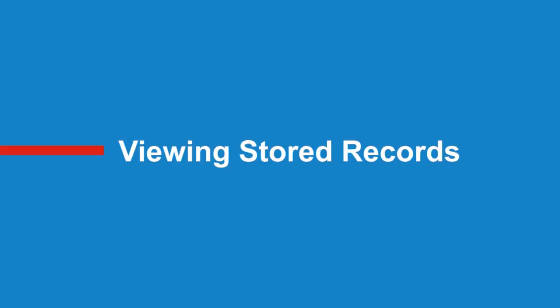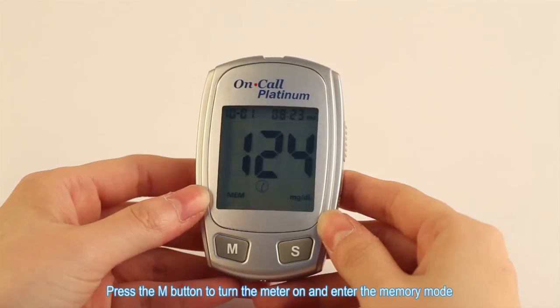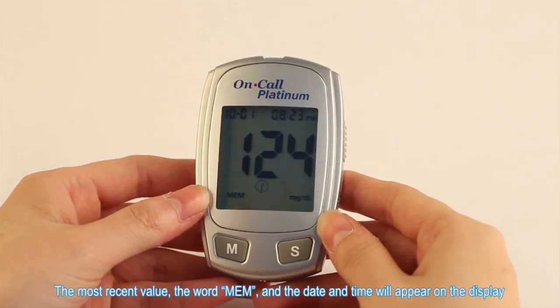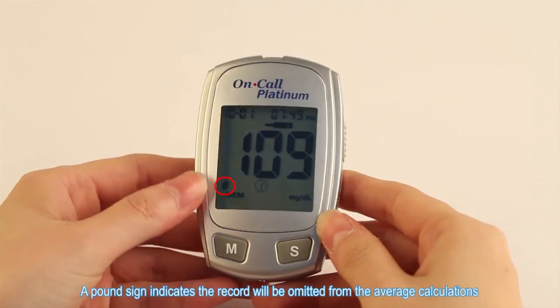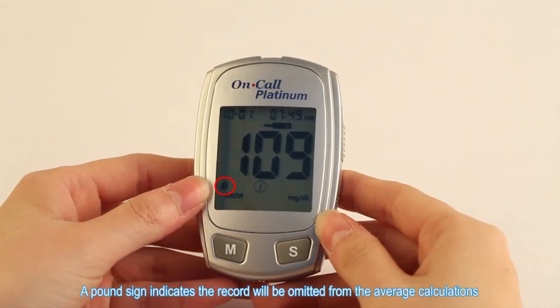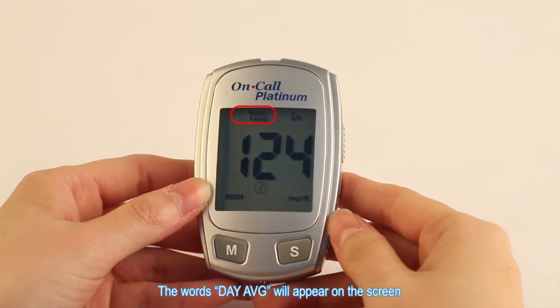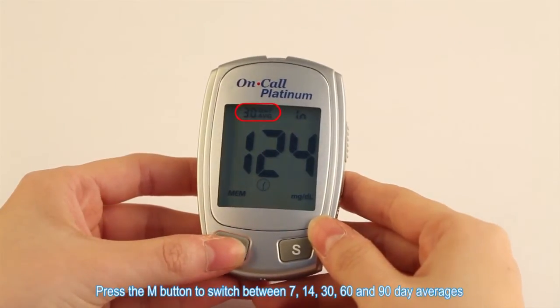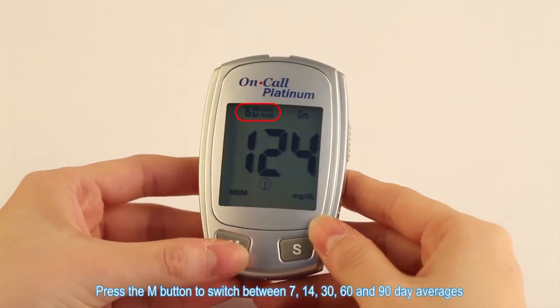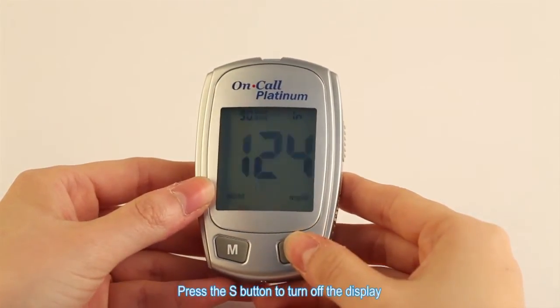Viewing stored records. Press the M button to turn the meter on and enter the memory mode. The most recent value, the word MEM, and the date and time will appear on the display. Press the M button to go through the stored records. A pound sign indicates the record will be omitted from the average calculations. Press the S button to view the result averages. The words 'day average' will appear on the screen. Press the M button to switch between 7, 14, 30, 60, and 90 day averages. Press the S button to turn off the display.